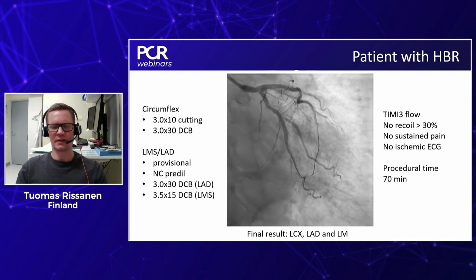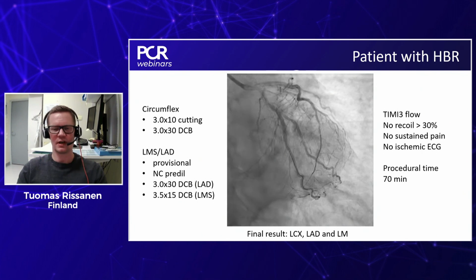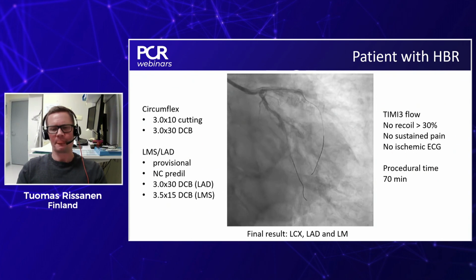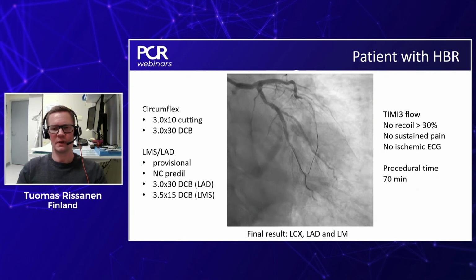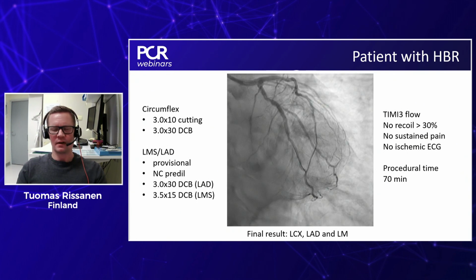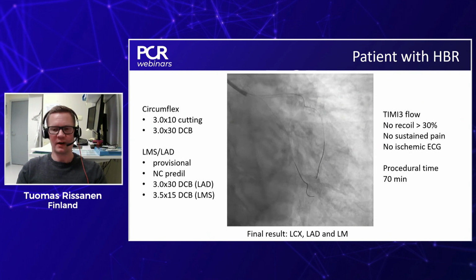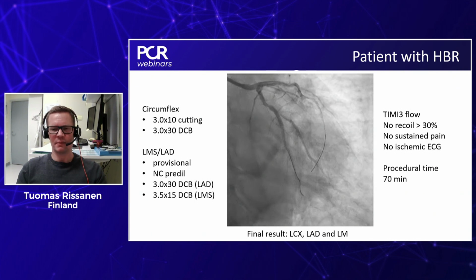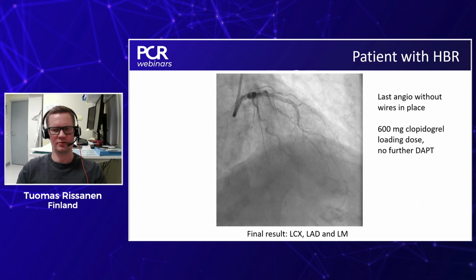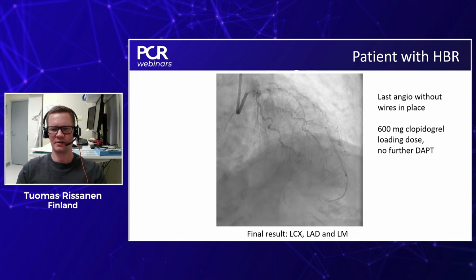The left main is a little bit problematic in some patients because, as you may imagine, there is quite often a drop in the blood pressure, ECG changes. But what we have learned is that at least in case of paclitaxel coated balloons, 15 to 20 seconds in left main should be enough according to animal experiments done in the past. And then in the end, again, we evaluate the patient, look at the ECG, and what is very important is that using DCB on at least some of the lesions, you probably save some time, especially in terms of bifurcation treatment. And this is also very important here in the left system, that you obtain your last angio without any wire in place.